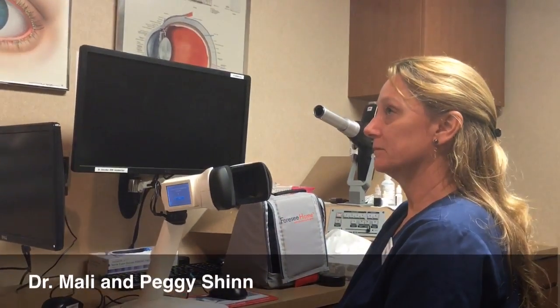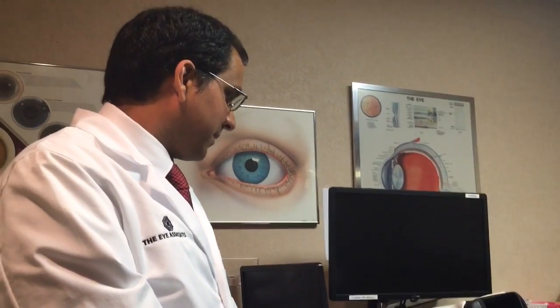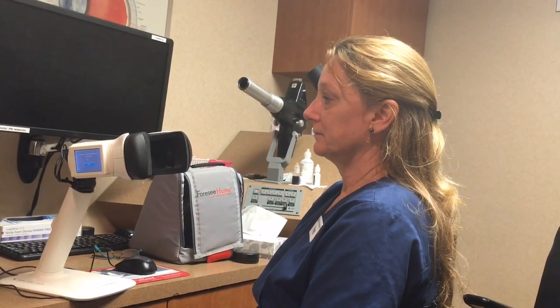So Peggy works here in our operating room and she's going to be subbing as our patient today. She's going to be utilizing this device. It's called the ForeseeHome AMD device, which was just recently approved by Medicare for detection of changes from the dry type of macular degeneration to the wet type.